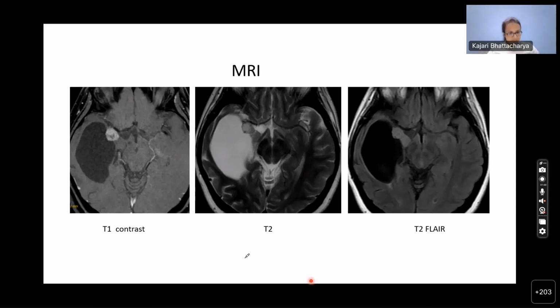And therefore, my radiological differentials will be a circumscribed astrocytoma, whether a pilocytic astrocytoma or another circumscribed type, or it could be a pleomorphic xanthoastrocytoma or a glioneuronal tumor like a ganglioglioma. Excellent. So cyst with the mural nodule, please remember temporal cortex, and she has very nicely described three differential diagnoses. So just one point, Vani.